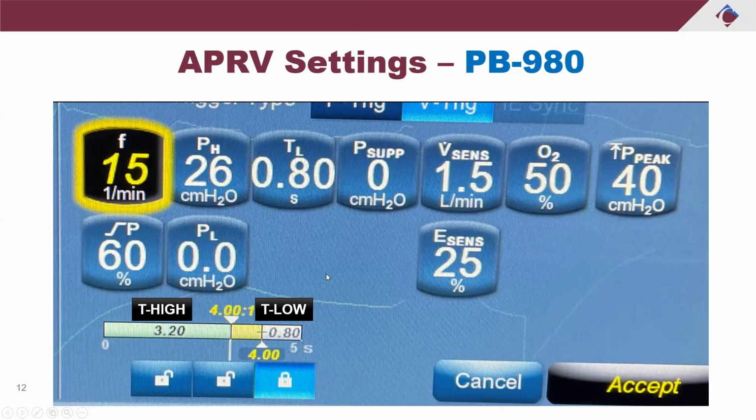So when you're setting up bi-level on the 980, what I recommend is you always want to lock the time low in. Once you've dialed it in where you want it, you want to lock this function. So every other change you make, whether it's with the pressure or the frequency, because your frequency now, this control here, is what's going to control your time high. So you should know that if you decrease your frequency, your time high is going to increase. It's going to go out farther, so you're going to create fewer releases. If you increase frequency, let's say you go from 15 to 20, your time high is going to shorten up to probably close to 2.5, 2.2, somewhere around there.